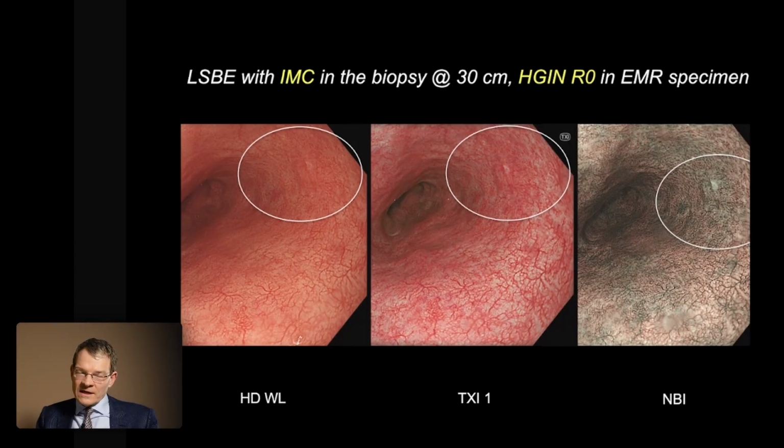Yes, I fully agree. It is also the point that when you want to perform a resection, you need to present this case in the tumor board, and then they also ask for the histology. So a biopsy is necessary, and we are not perfect for sure, but in this case we have somewhat more difficult imaging with regard to the infiltration depth because there has been a biopsy before, but I think this has no consequence with regard to the treatment strategy. At the end, we don't know what the biopsy causes, etc.